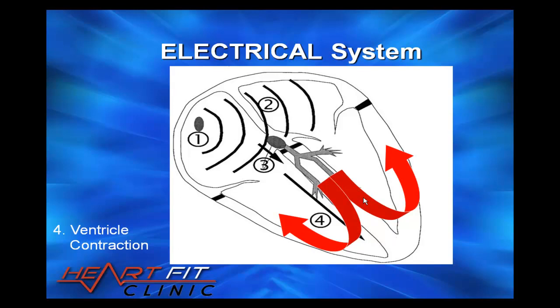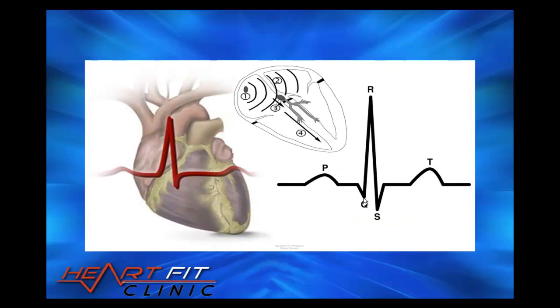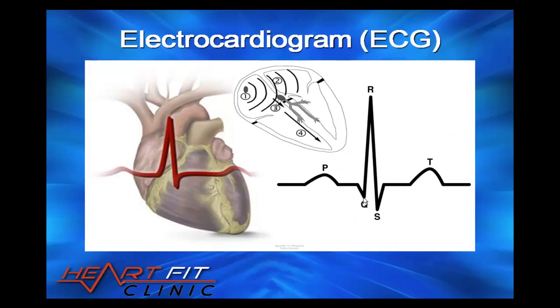Now, all of this can be picked up by an ECG, or an electrocardiogram. You can see with the electrocardiogram, they stick these stickers on you. Of course, you can see our diagnostics presentation, but the electrocardiogram picks up this electrical signal from your heart.